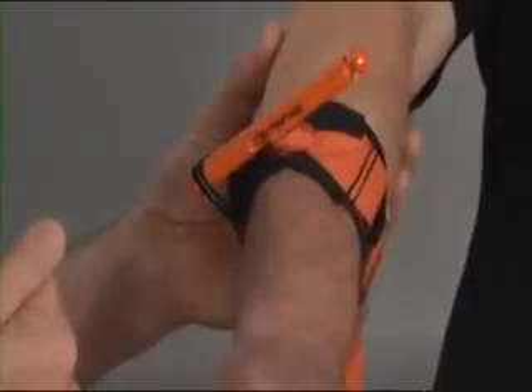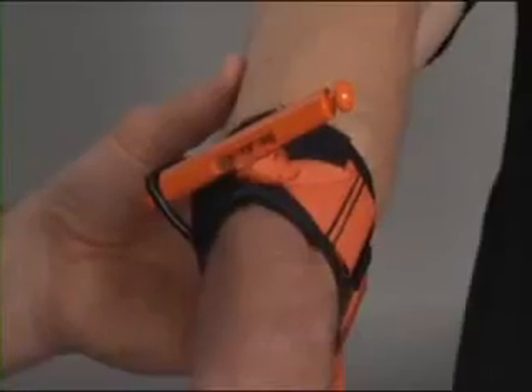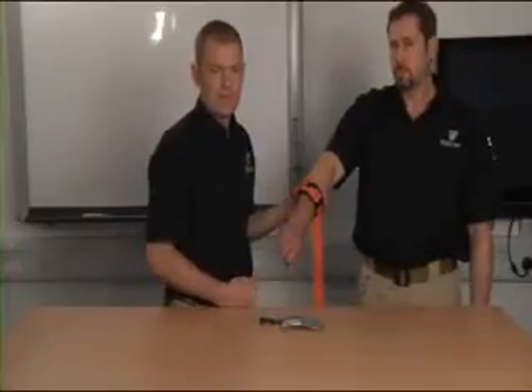In some military systems, the letter T for tourniquet is written on the patient's forehead along with the time of application. The reason for this is that when we hand over the patient, it is crucial to hand over that an arterial tourniquet is in place and at what time it was applied. The application of a tourniquet is in itself uncomfortable, and over time the ischemia beyond the tourniquet will also lead to further pain, so analgesia is very important.